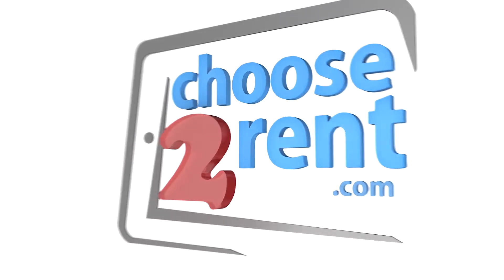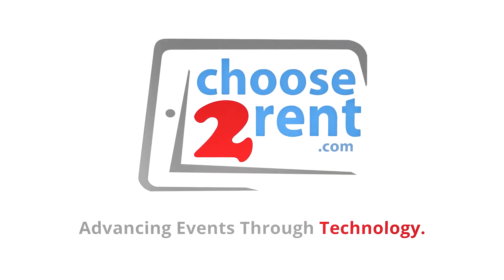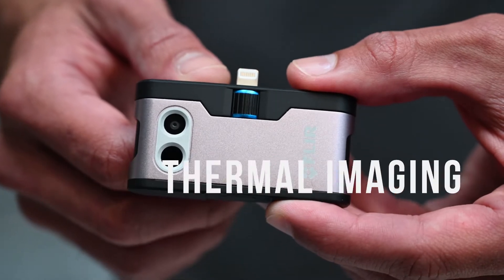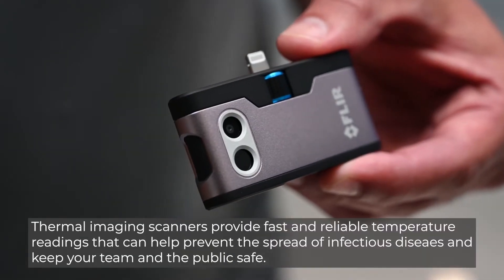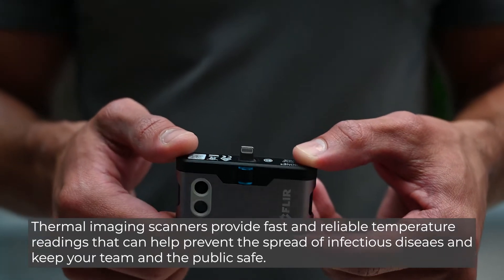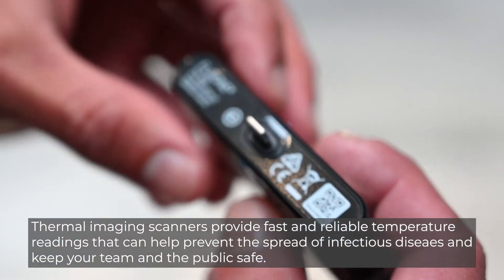Choose to Rent — advancing events through technology. Thermal imaging scanners provide fast and reliable temperature readings that can help prevent the spread of infectious diseases and keep your team and the public safe.